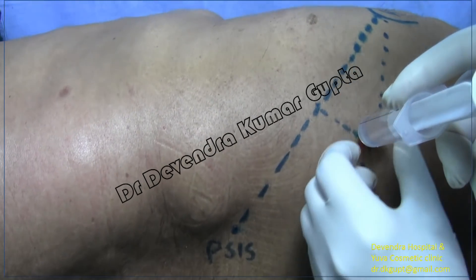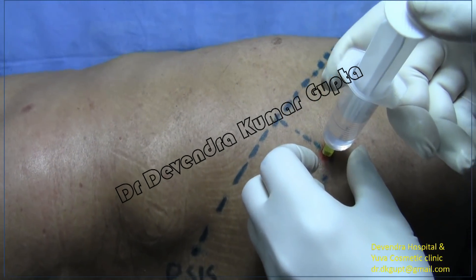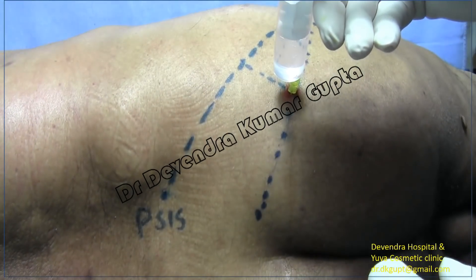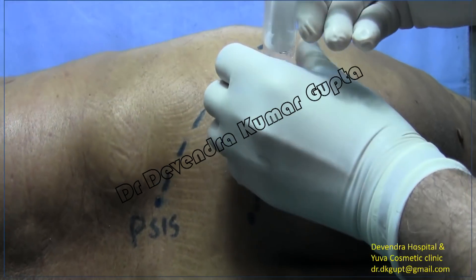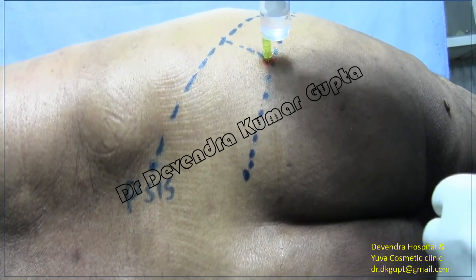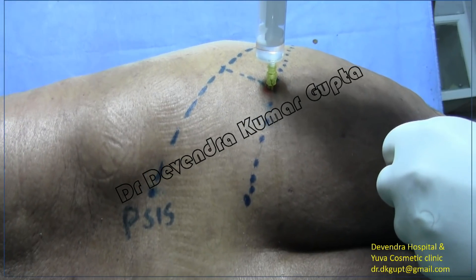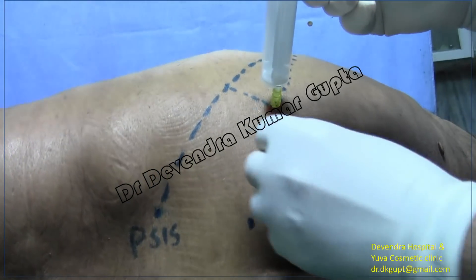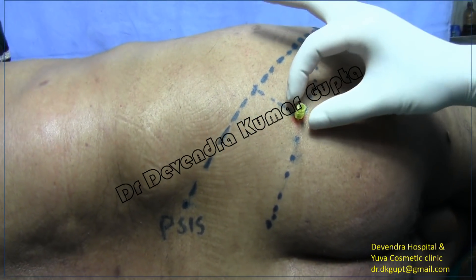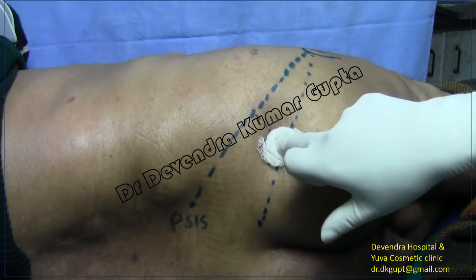Start injecting, always rotating the syringe in many directions to avoid accidental intravascular injection. There is no blood on aspiration and there is free flow of the solution without any resistance. Rotate the syringe again — no blood. The block is complete. Remove the syringe and see — regurgitation is there. Just massage the area; the sciatic block is complete.